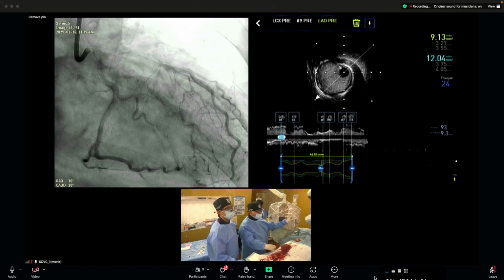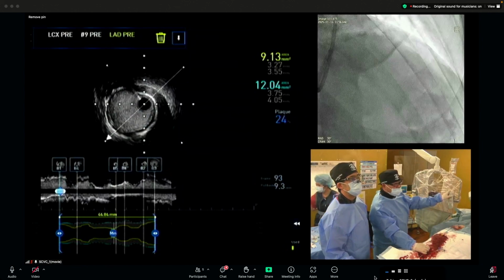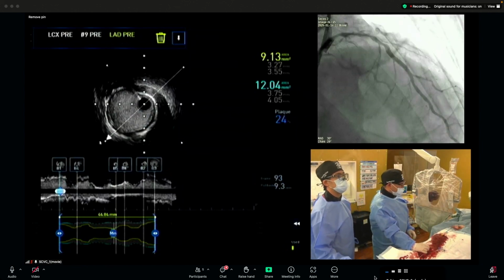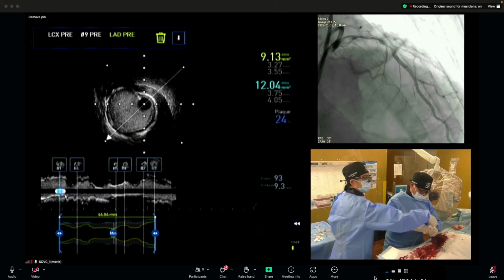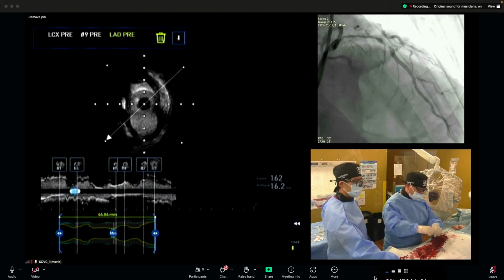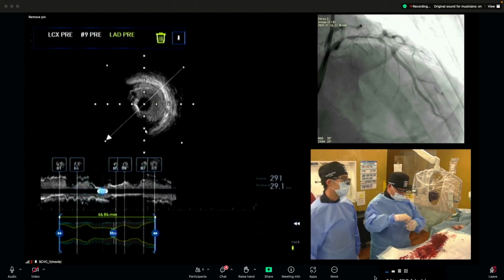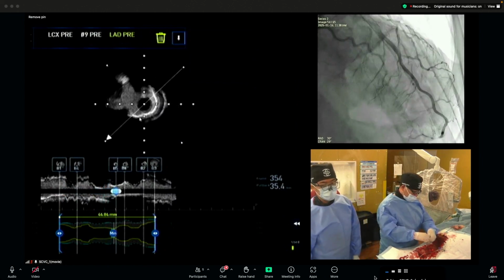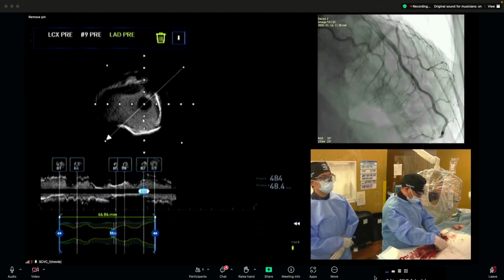Okay, thank you very much, Kashima Sensei. Adrian, can you see the IVUS on your screen? Yes, we can see very well. I want to review the IVUS quickly. This is the IVUS pullback from distal LAD, and now the septal is coming from 6 o'clock, and we can see the superficial calcium. This is a diagonal branch, and we can see a very diffuse region.